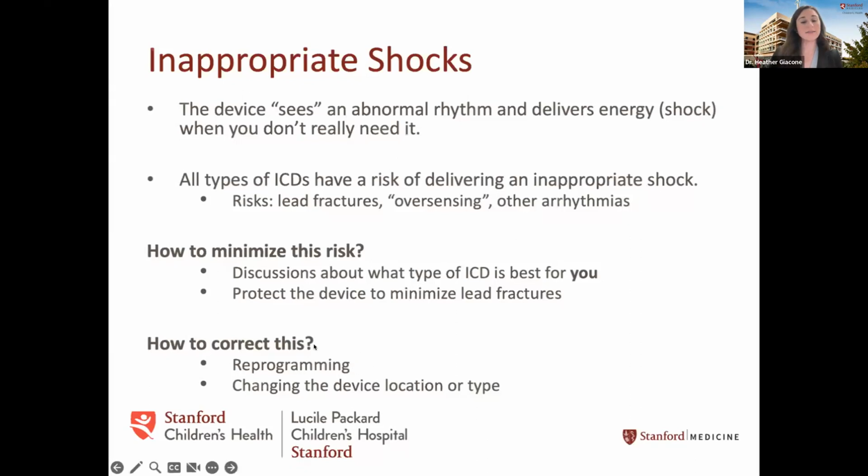So again, lots of this can be done with just reprogramming. If the lead is fractured or we cannot reprogram it for whatever reason, we may start discussing changing the device location or type.